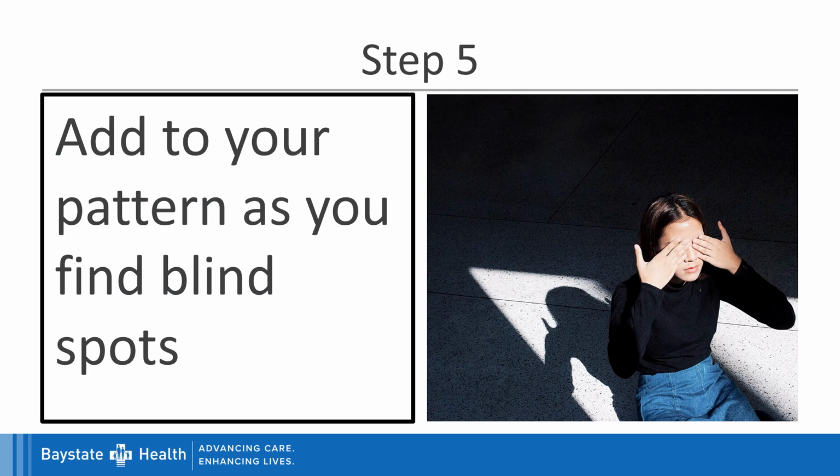Step 5, the final step. It is okay to add things to your search pattern over time. You will start to recognize areas that are blind spots for you over time, and that is totally normal. What you should do is add those blind spots to the end of your search pattern so that you make sure that you are still looking for them, but it does not interfere with what you have established as your baseline search pattern. And this avoids you missing things in your search pattern because you have now stepped outside of what you are familiar with.